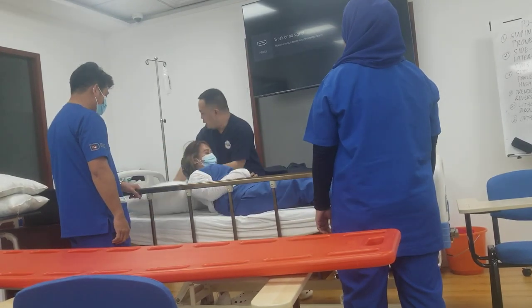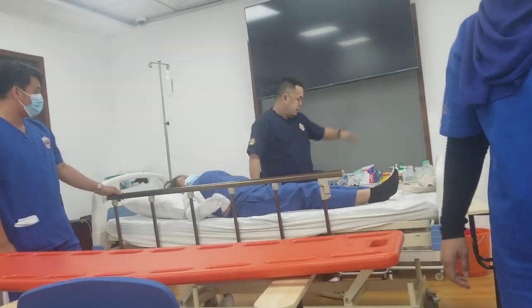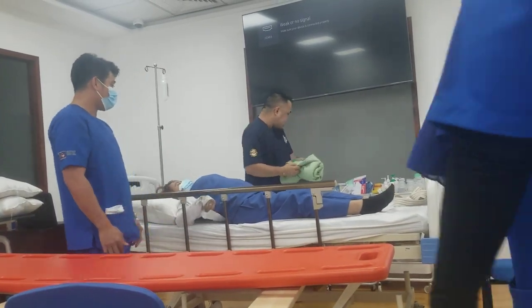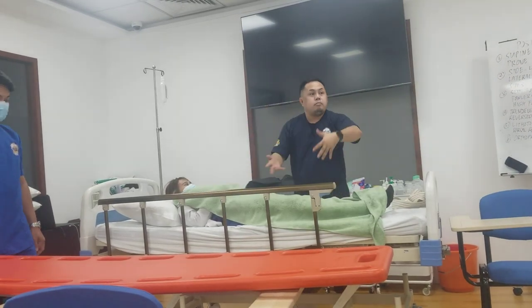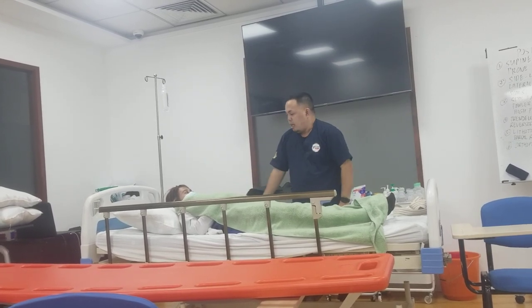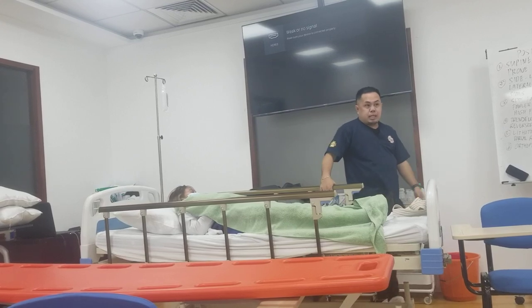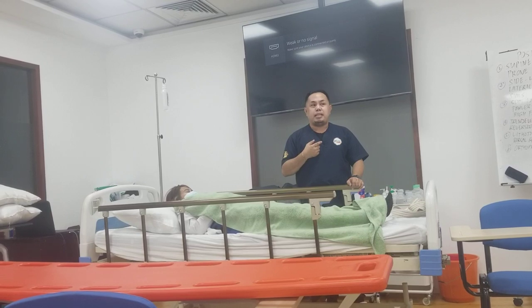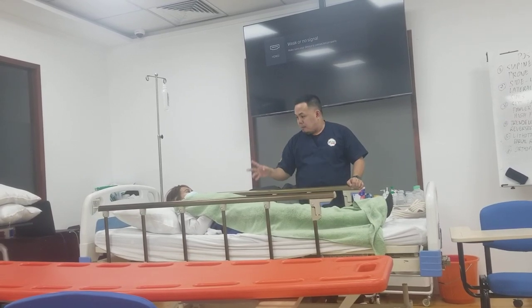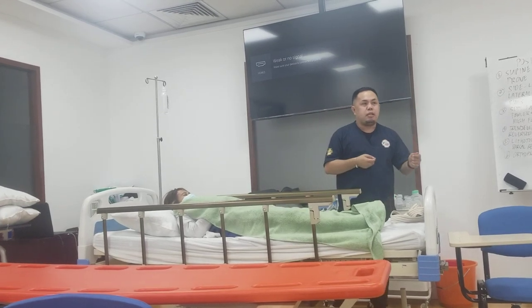Provide comfort by putting a pillow under the patient. Get a blanket and cover the patient to avoid exposure during transport. Put the side rails up, unlock the wheels, and with your colleague, take the patient to the examination room.